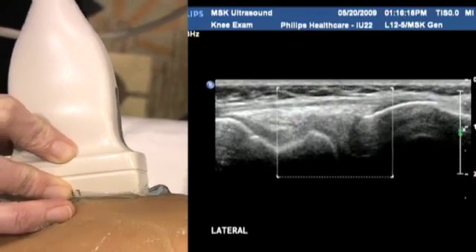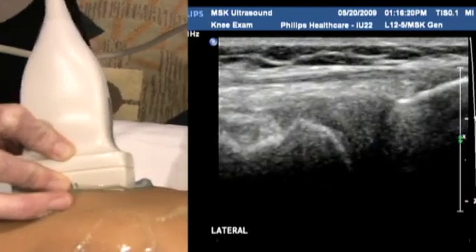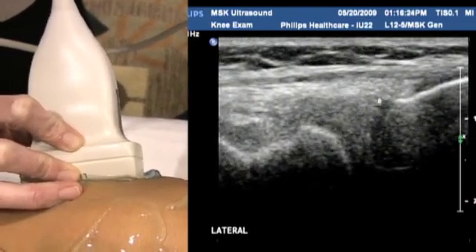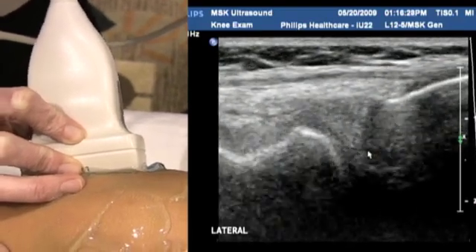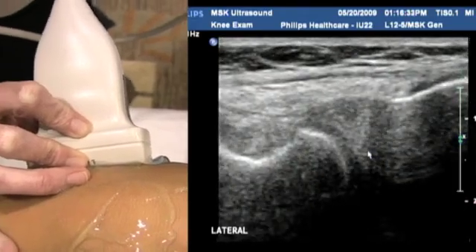We can really zoom up on that meniscus here, covering this entire portion here. Again, you can approach this from posterolaterally. Some people have quite a bit of success with that approach. I find that the straight lateral approach is quite effective also.